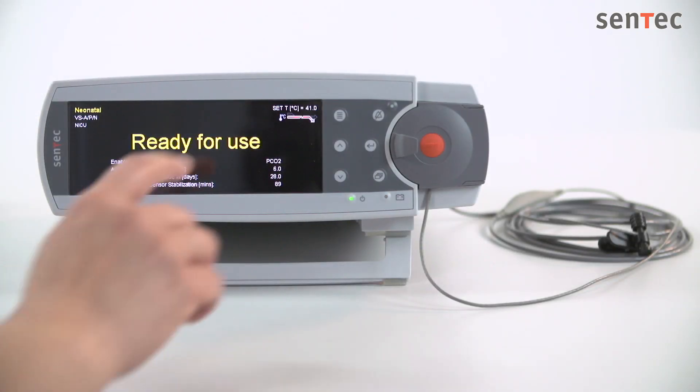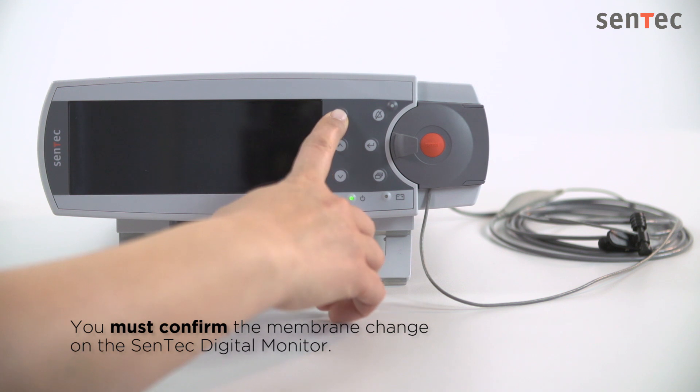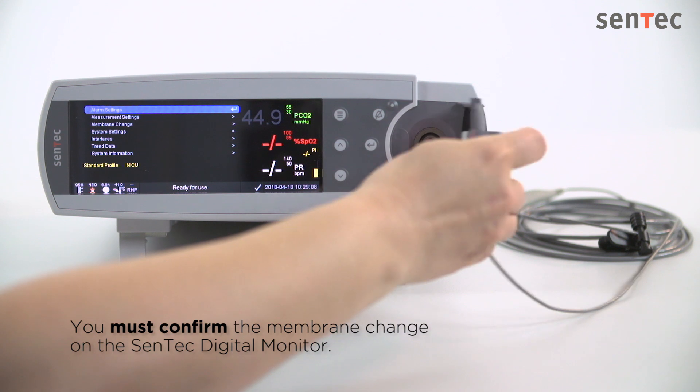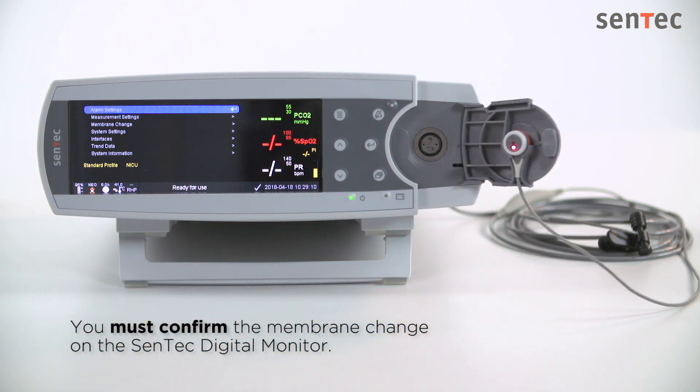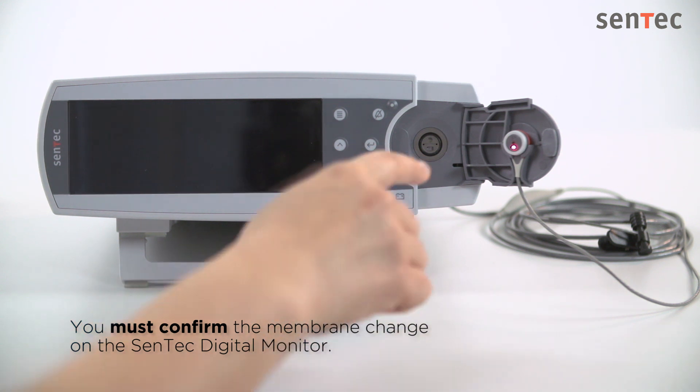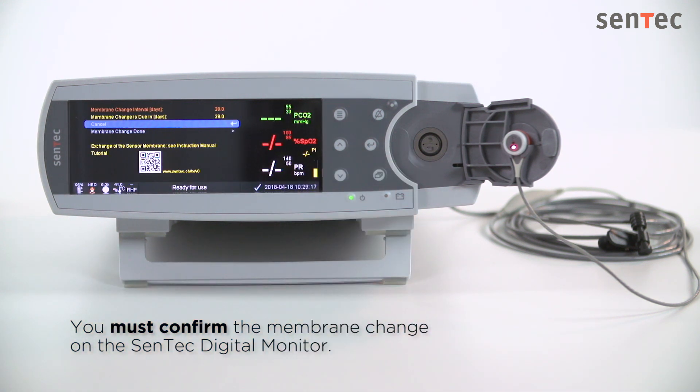Before the sensor can be used, you must confirm the membrane change on the CENTEC digital monitor. To do this, open the docking station door and select Membrane Change Done. This will reset the membrane change timer and initiate a mandatory calibration.